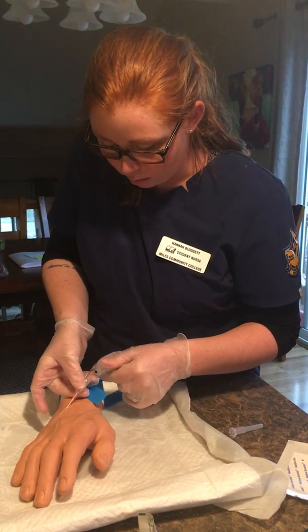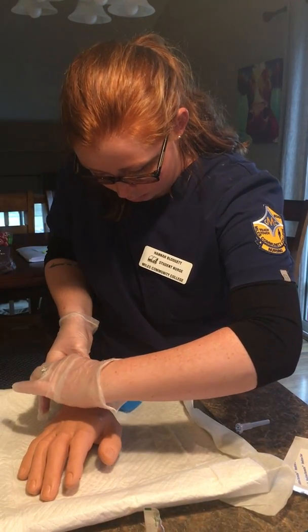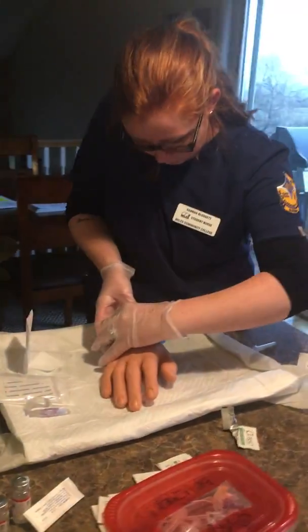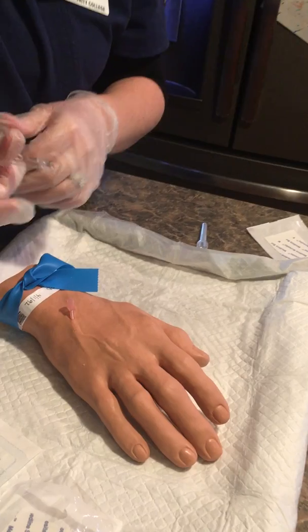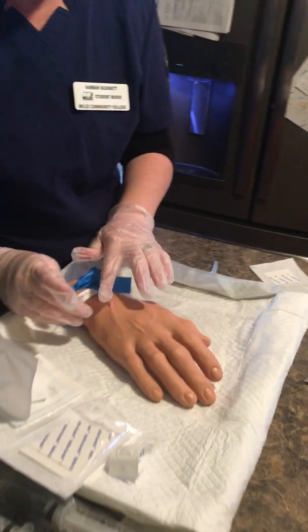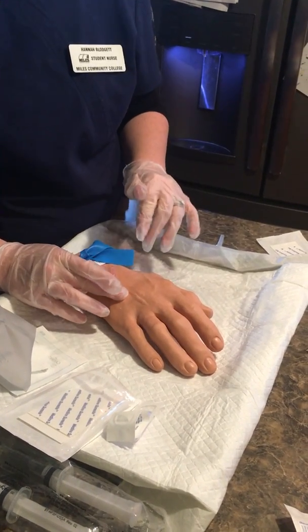Okay. Then with this hand, I can go ahead and advance the catheter and pull out on the needle. Go ahead and safety that. Discard of my sharps. And I want to make sure that the catheter is in the vein.